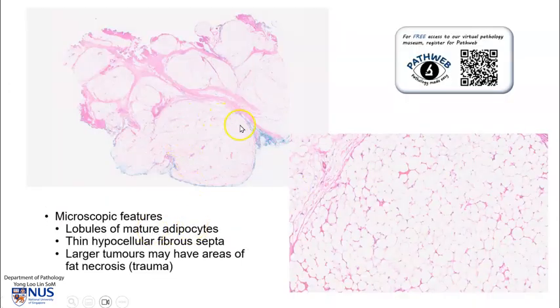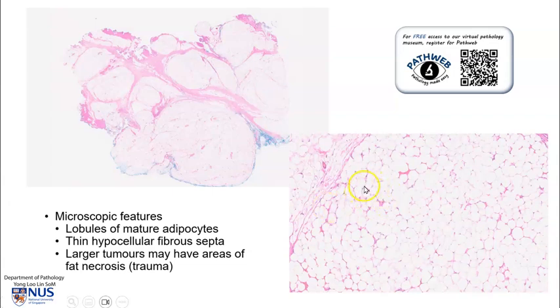Microscopically, they are composed of lobules of mature adipocytes, and sometimes we can see thin fibrous septa that are made up of collagen. Here, we can see the adipocytes, which appear very empty because the fat is washed out during processing of the tissue into microscopic slides, and the nuclei are compressed to the edge of the cell.